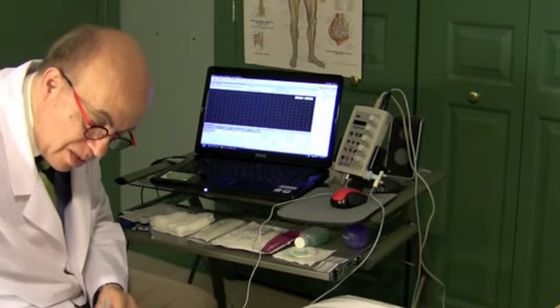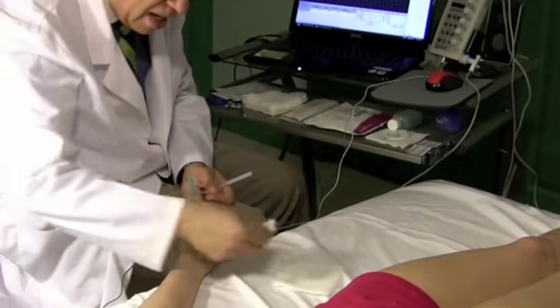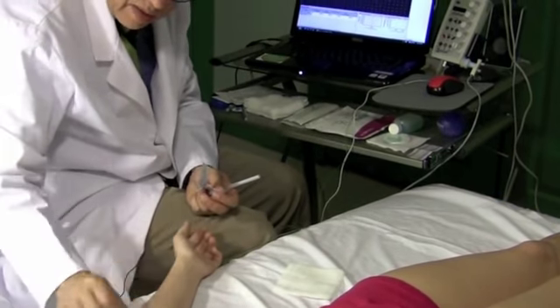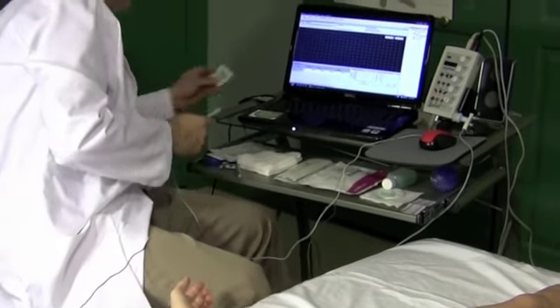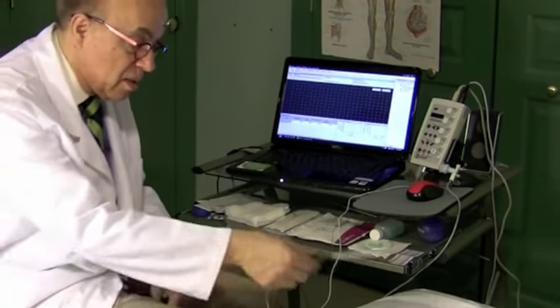with alcohol. And what I like to do is wipe the areas that I'm going to study, so that if I ever forget to wipe it, I've already wiped it. To be honest with you, I don't think this alcohol does anything. I think it makes the doctor feel better. But at any rate, it might also make the patient feel better. Now, what am I missing in doing this?